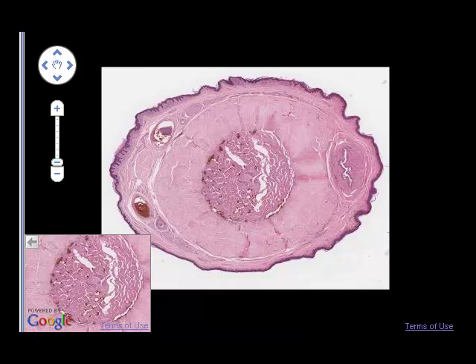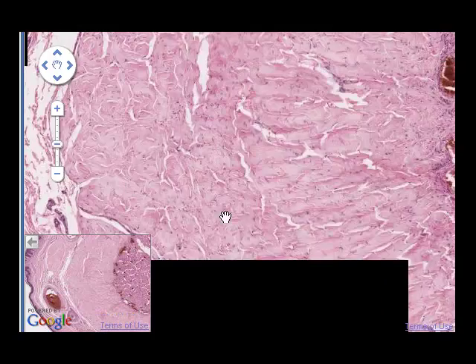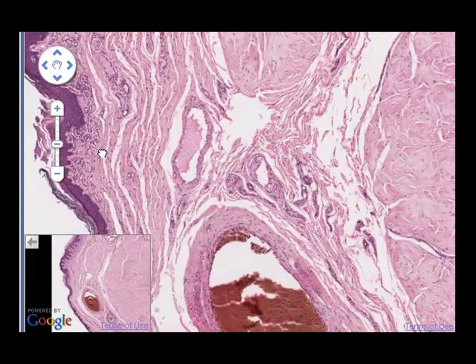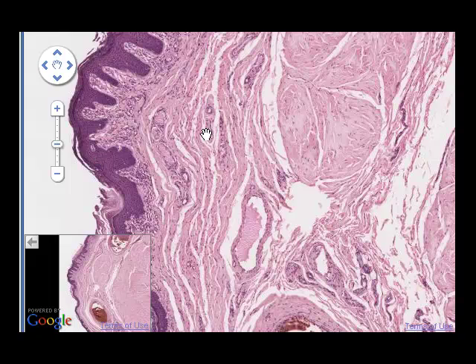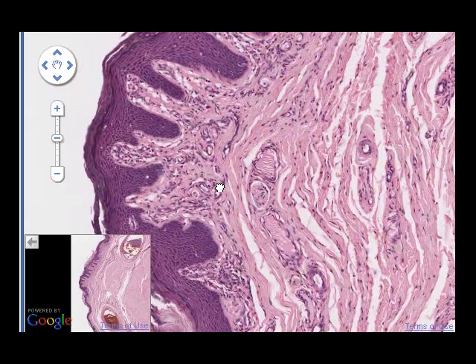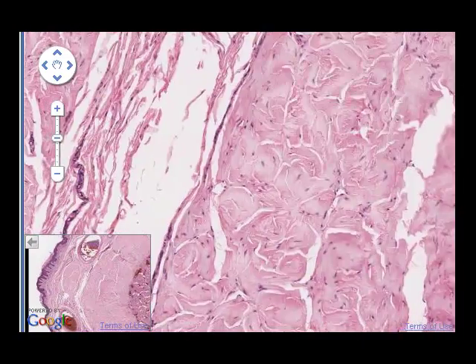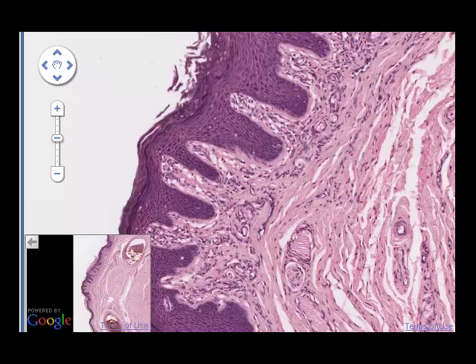NYU Virtual Microscope slide. So to begin with, we'll increase magnification somewhat, and we'll concentrate on looking just beneath the epithelium which covers the surface of the penis, which is skin, stratified squamous keratinized epithelium. You can take this opportunity to revise the appearance of stratified squamous keratinized epithelium if you wish. Where we're going to look for loose connective tissue, as it's most commonly seen, is in the area directly beneath the epithelium itself. And a little deeper within the penis, in a few minutes we'll look at dense irregular connective tissue for comparative purposes.